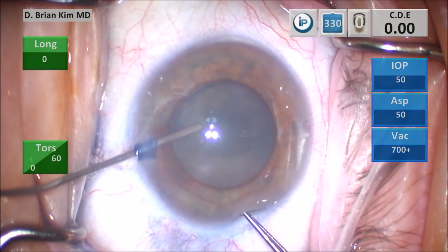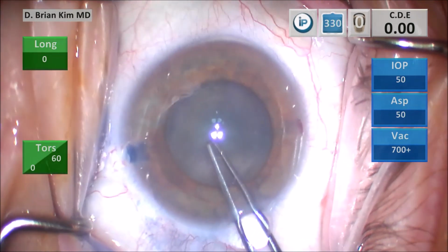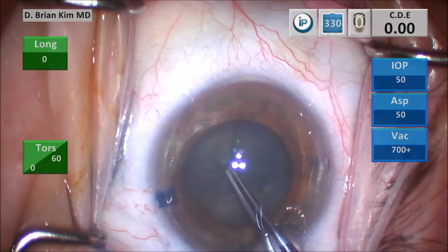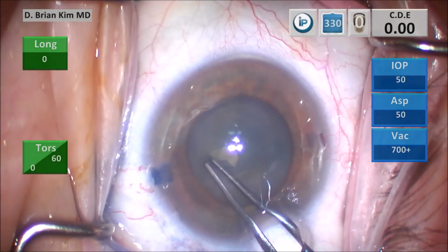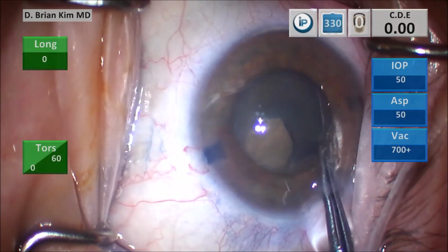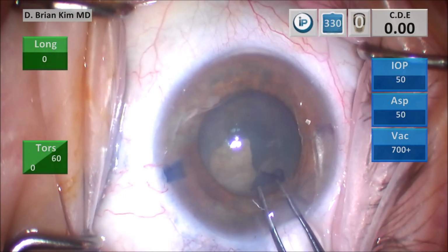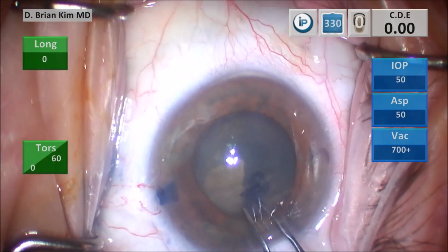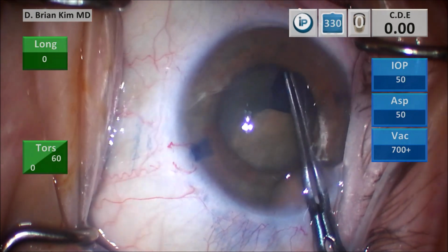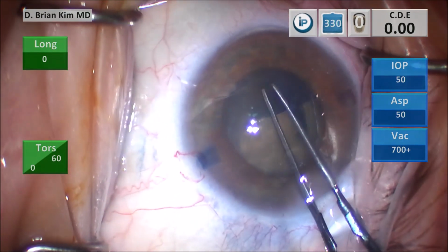And then this is a puncture style rhexis. I'm going to use the forceps to puncture the central capsule, creating a flap on the left side going around circumferentially. And you want to make a larger size rhexis rather than a smaller size rhexis when you're dealing with these very dense lenses.